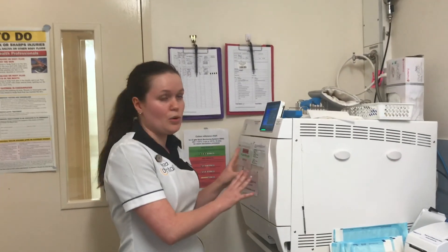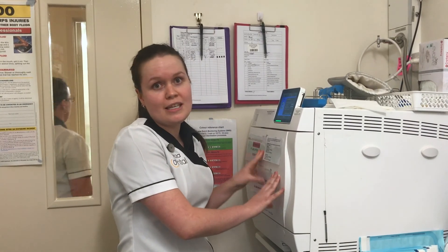Then they go into our autoclave. Once they're processed in the autoclave, they are sterile and ready for patient use, and they're transported over to the clean side of the room.